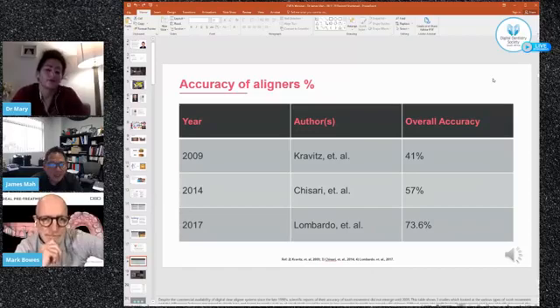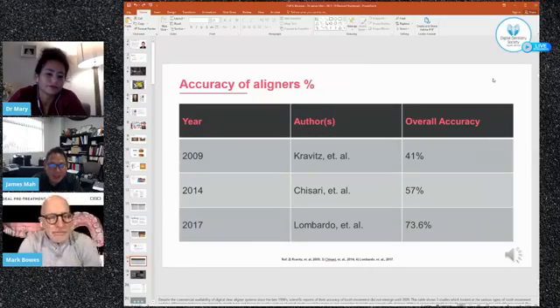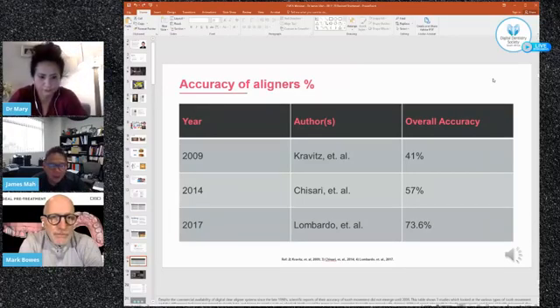It is the nature of aligners. Unlike fixed appliances that are directly bonded to teeth, aligners are not directly bonded. So it's no surprise that there is a little bit of treatment lag. People have different ways to overcome the lag, and one of them is to do a revision to catch up for that lag. And this is, again, why you need a clinician, somebody with experience to see that this is now lagging, it's not getting where I want it to be, therefore I need to do an action.